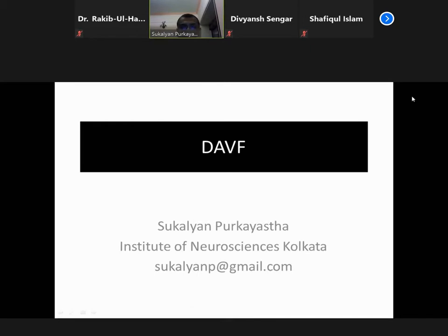The good thing about DAVF is that this is one of the lesions of the brain which can be totally cured with neurointervention. Arteriovenous malformations of the brain, the pial malformations, are sometimes very difficult to treat, and the risk is also high. But in DAVF, I feel the risk of endovascular treatment is substantially low compared to AV malformation of the brain, and we can do a great job in treating DAVF in an endovascular way.